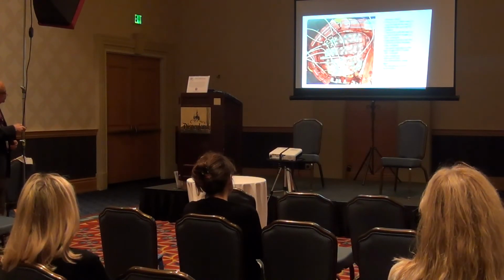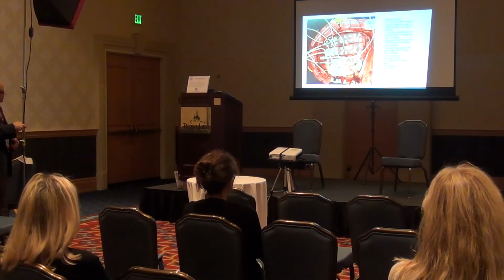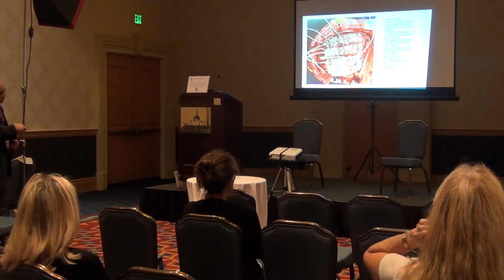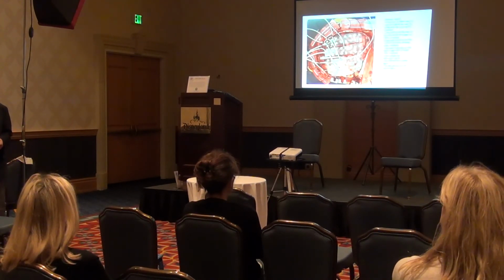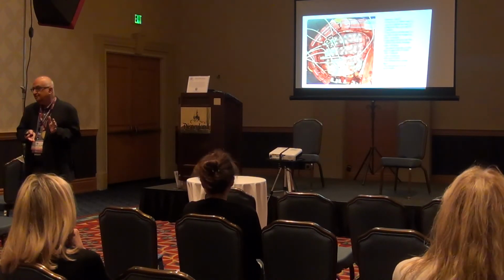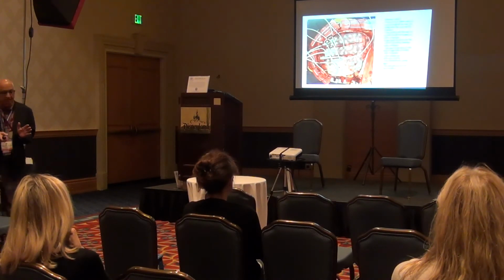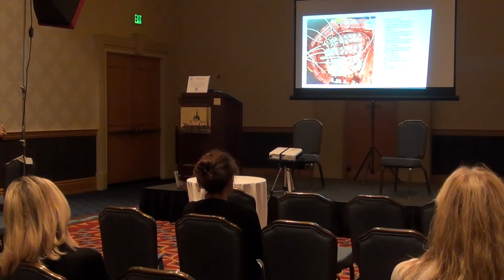Then you also see what we call grids. See, this is a 2x8, 2x8, 4x8. So you can see now, just in that little zone, there's a large number of electrodes, right? And actually, I didn't even show you all, but they're described here.